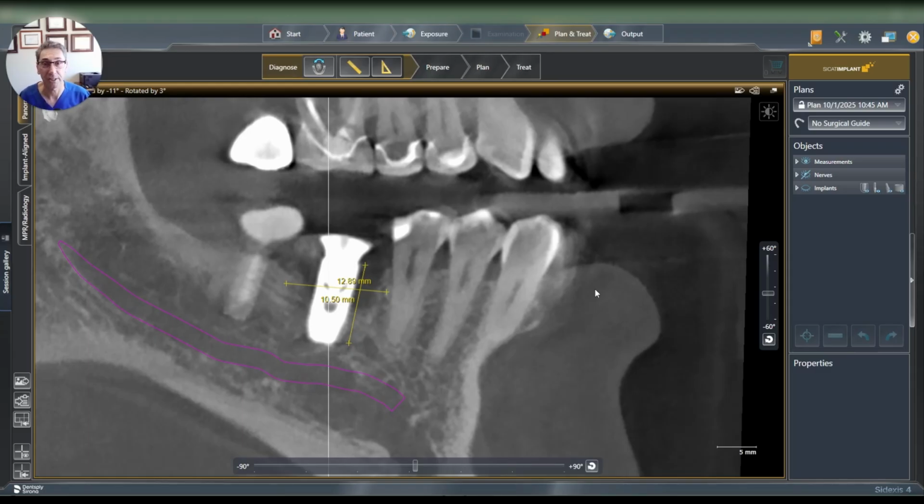Stage 1, explantation: remove the implant, clean up and let the tissue heal. Stage 2, come back and do the bone regeneration, to generate the bone. And then stage 3, do the implant placement. So from start to finish, these cases take more than a year to get the tooth back for the patient. But with this novel technique that we describe right now, we can do everything almost in one stage.